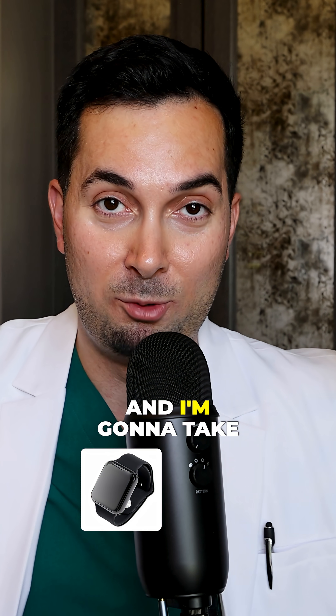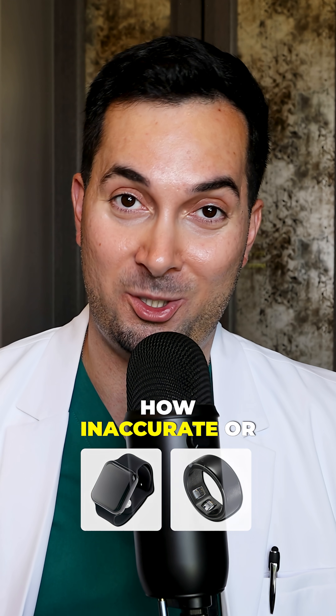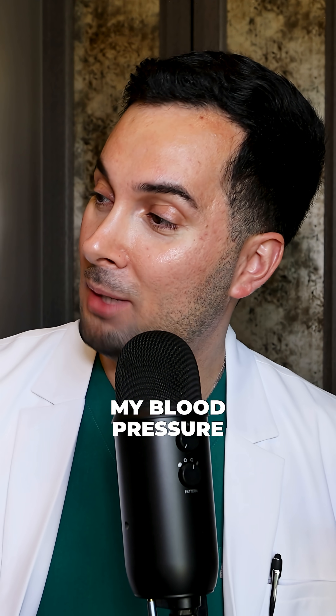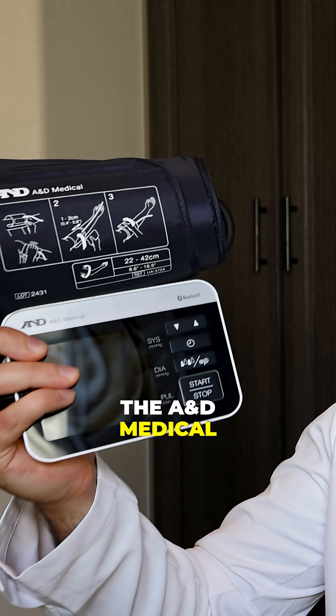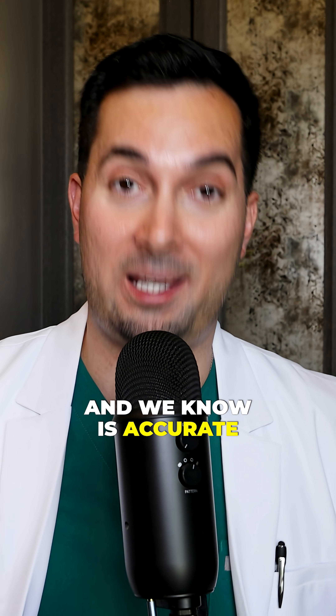I'm going to take my blood pressure using a smartwatch and a smart ring and see just how inaccurate or accurate the readings are. In this experiment video I'm going to take my blood pressure properly using the A&D Medical Precision Check Pro device, which is on the VDL list and we know is accurate.